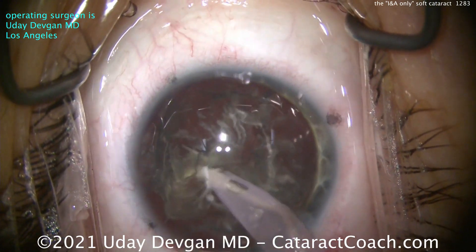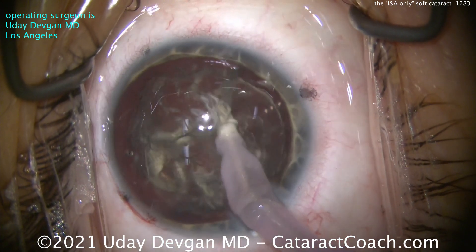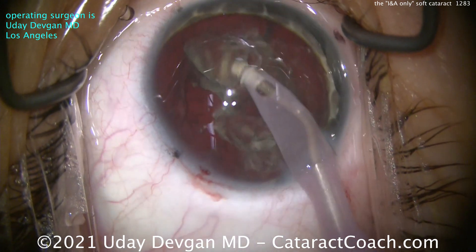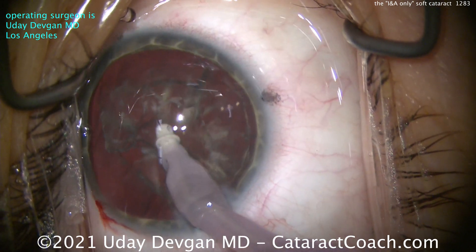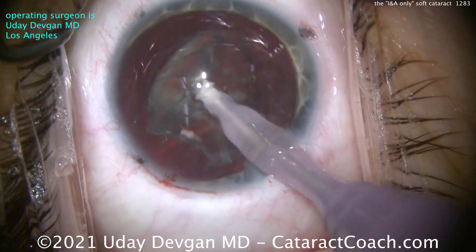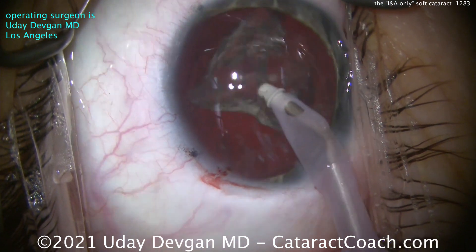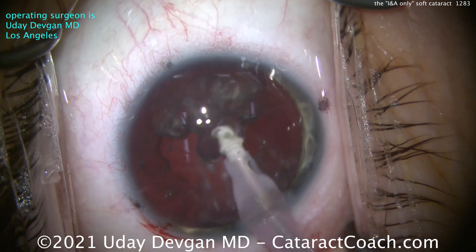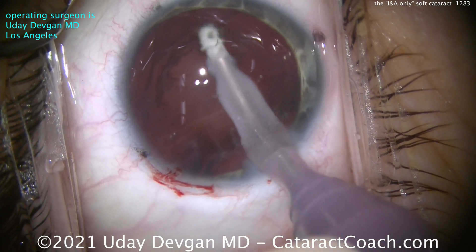We can aspirate the entire lens just with this. You can see there were a lot of lens opacities that, as we did the hydrodissection, it really highlighted them and made it very obvious — no wonder the patient's acuity was down in this eye. Given the history of some prior trauma, good news is we did not note any issues with zonular support. It looks like the patient has good zonular support 360, no looseness at all. I don't think we're going to need a capsule tension ring. The whole cataract is soft, so it all aspirates down very easily just through the IA port — no issues at all.